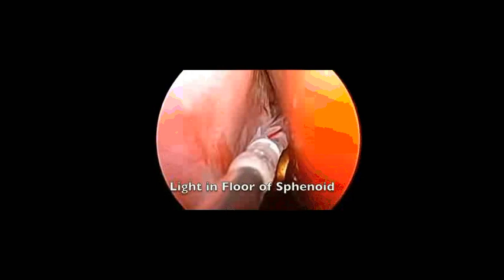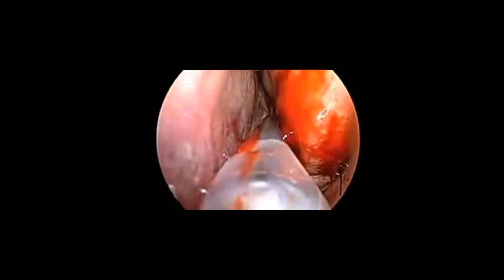Once the balloon is felt to be in the right position, it is inflated. This balloon is 5 by 24 millimeters, which is slightly large for the sphenoid, but is also needed for the frontal. The balloon is inflated incrementally to about 6 to 8 atmospheres, and then the balloon is deflated. This is all done under direct endoscopic visualization.